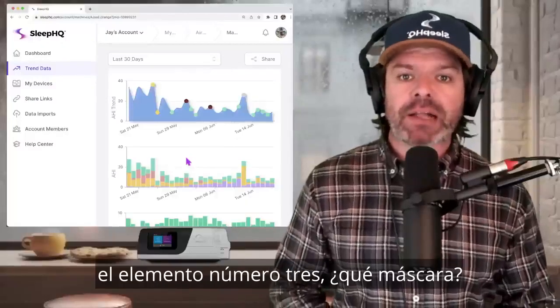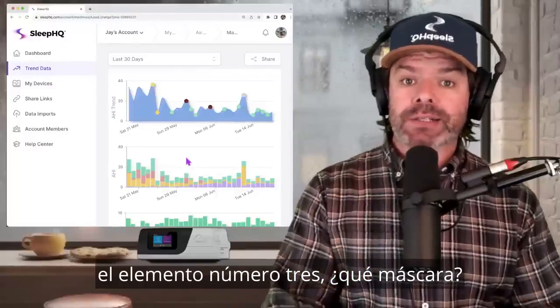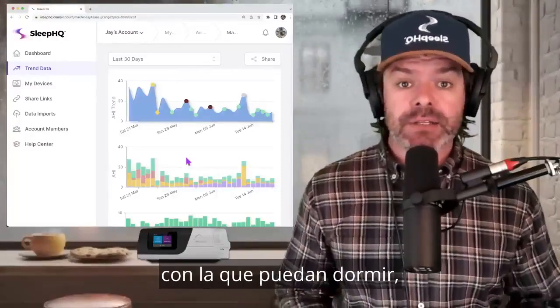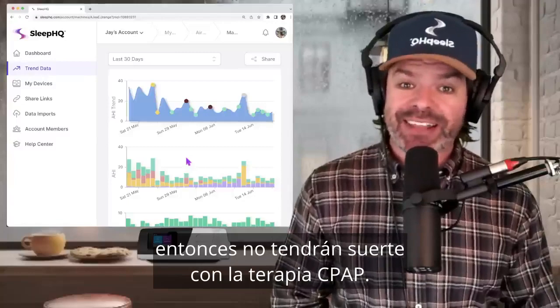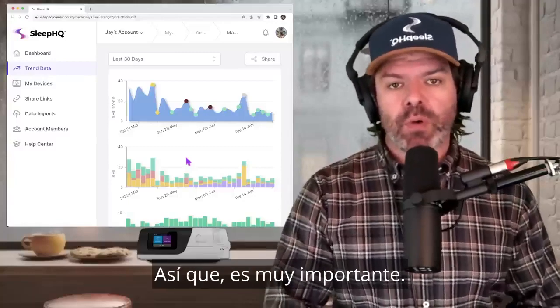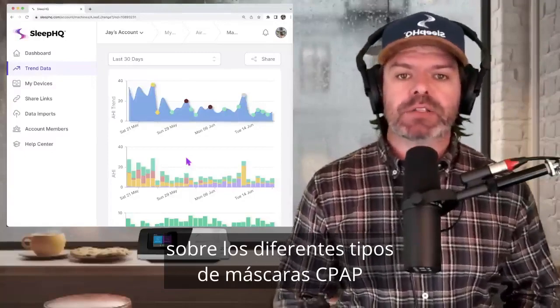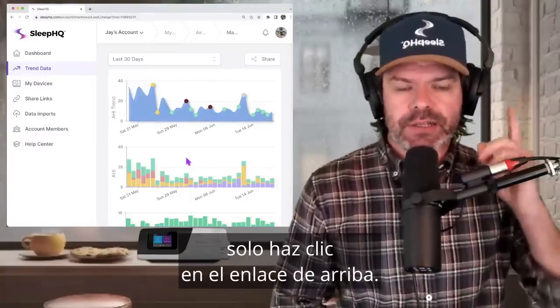And to finish up, element number 3, what mask? And this is crucial, guys. I mean, at the end of the day, if you can't find a mask that you can sleep with, then you're just not going to have any luck with CPAP therapy. So it's very important. And if you want to watch one of my videos on the different types of CPAP masks and the pros and cons of each, just click the link above.